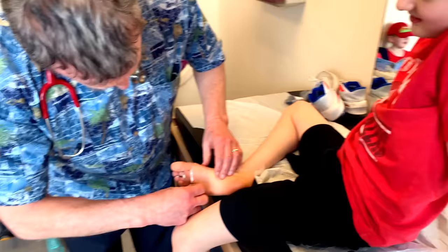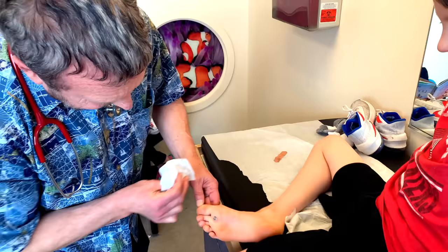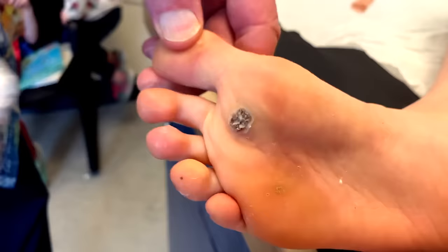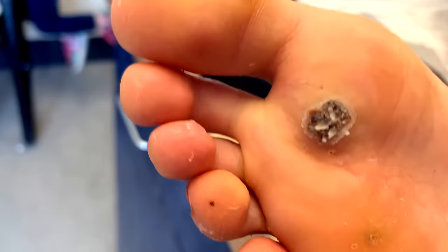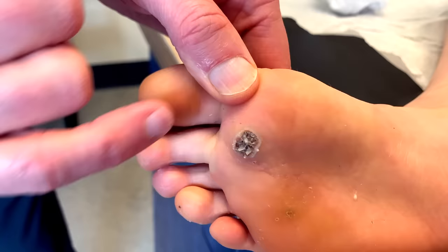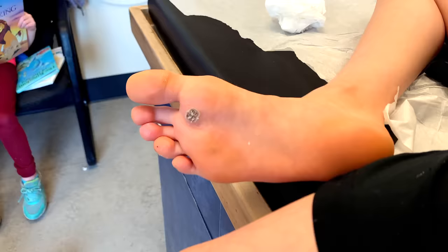Hello, how you doing? We're going to take a look at this. That white stuff we have on there is some lidocaine, prilocaine. Look at that, it's so cool. Get a real good close up, stay close up. And it almost looks like we've got two warts that are kind of sticking out. I'm going to go ahead and freeze them, but they're almost separating from their root.